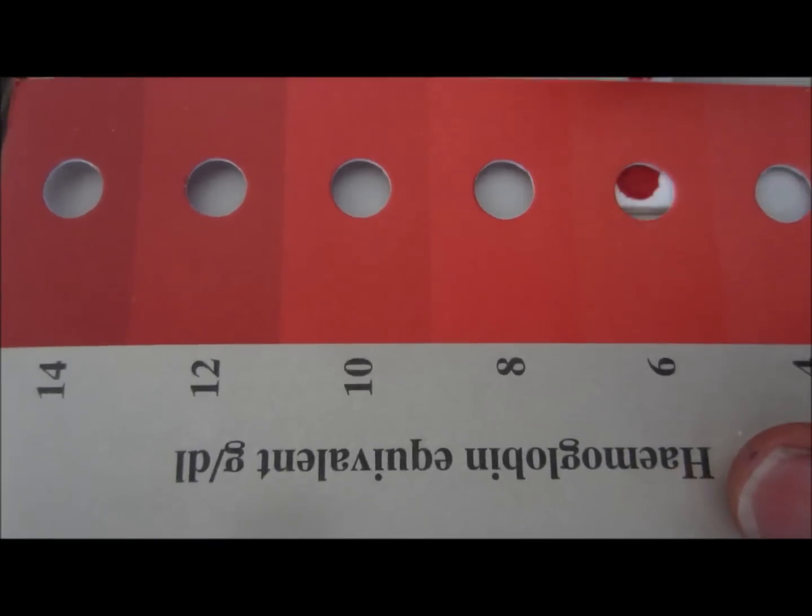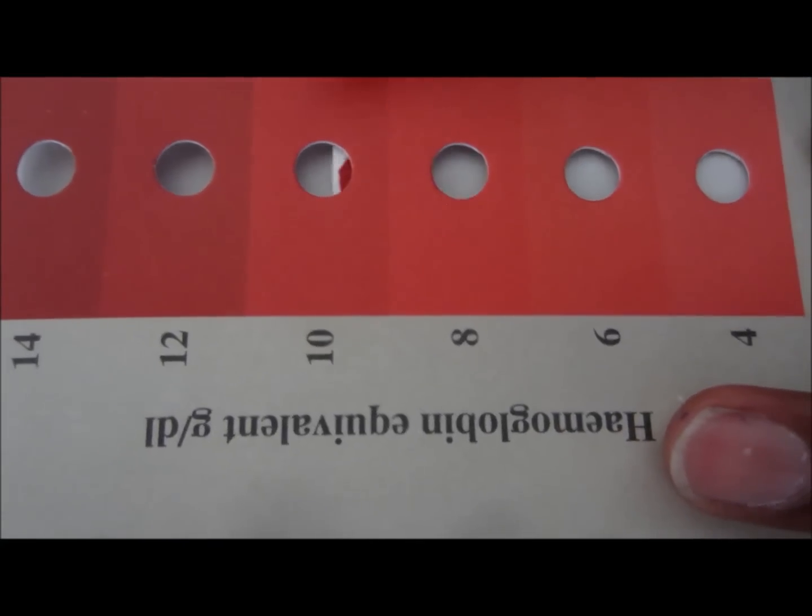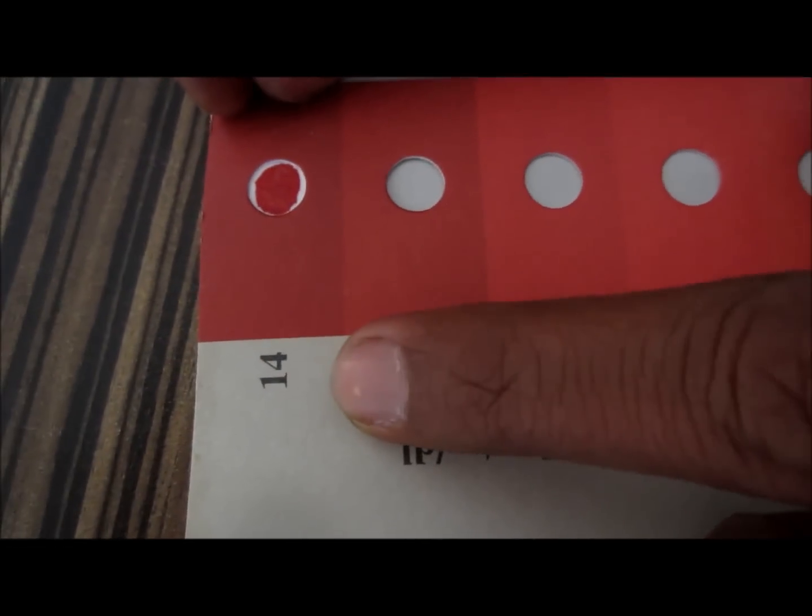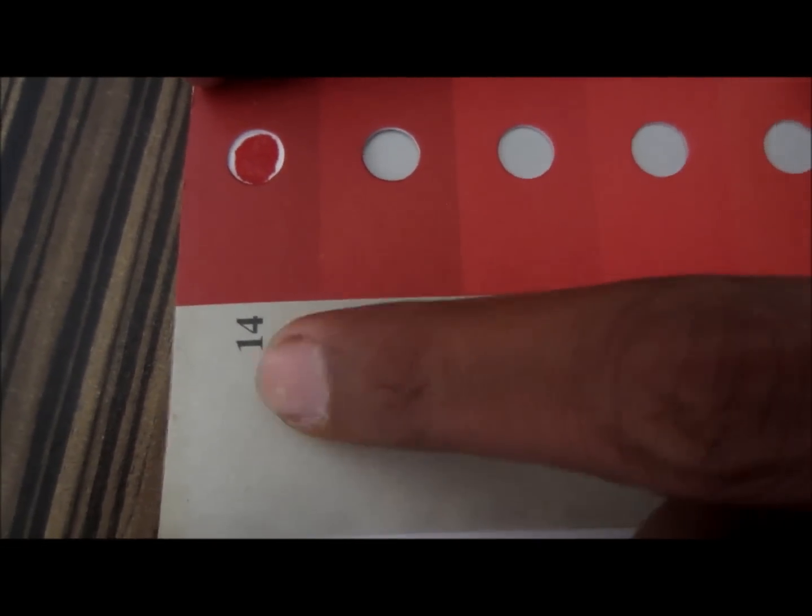For example, the six color is quite light as compared to the blood that we have in the strip. Now it's nearly equivalent to the 14, so the value is 14 grams per deciliter.